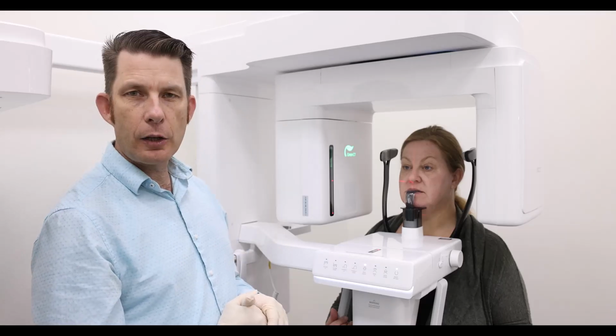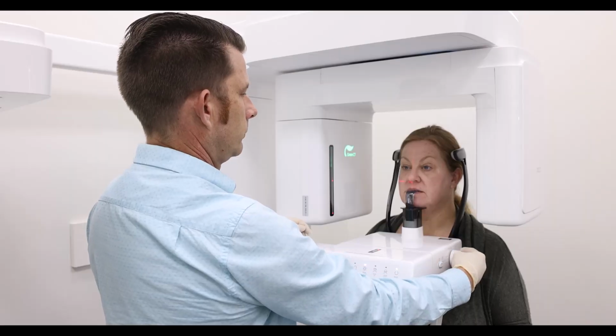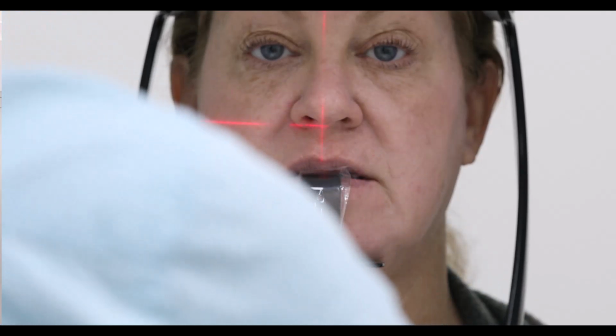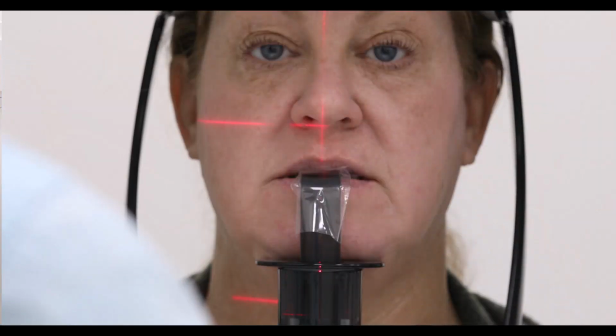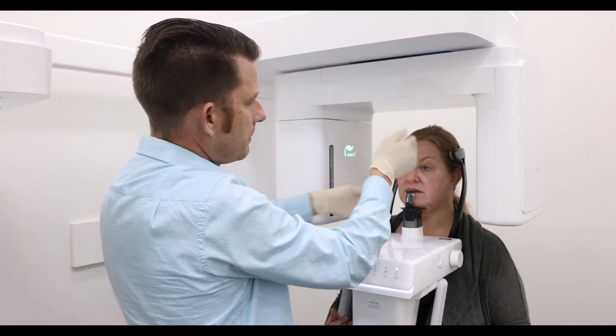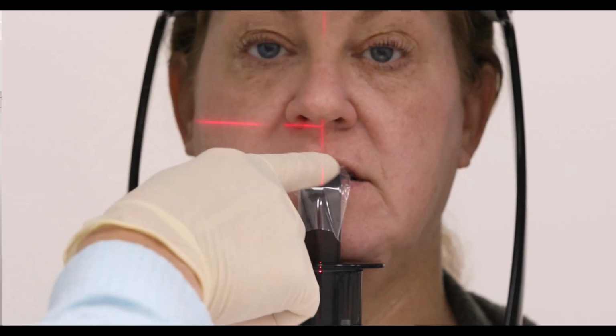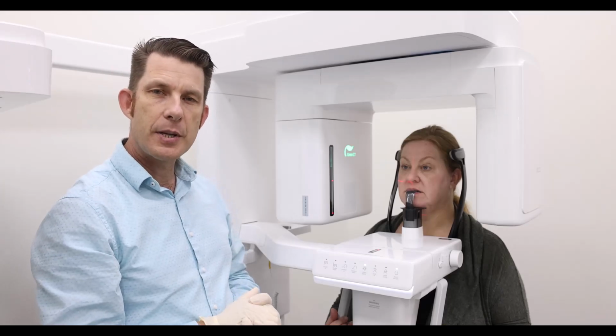Next, I'm going to go ahead and close my temple supports. And I want to make sure this is tight, so I turn it a couple extra times to ensure that the patient does not move. I'm going to adjust our patient's head a little bit to make sure they're lined up center, mid-sagittal beam right between the eyes and right through the philtrum. And now we are ready to capture our CBCT.